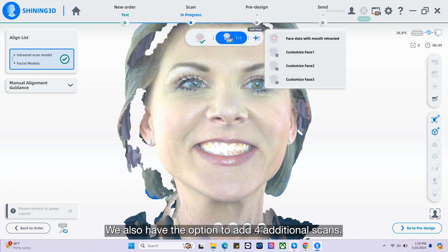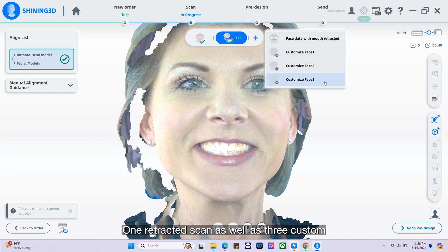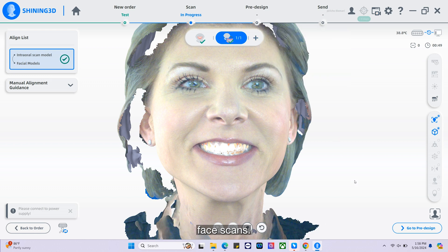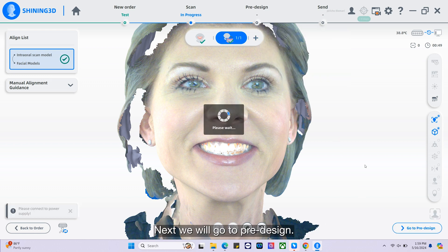We also have the option to add four additional scans: one retracted scan as well as three custom face scans. Next, we will go to pre-design.